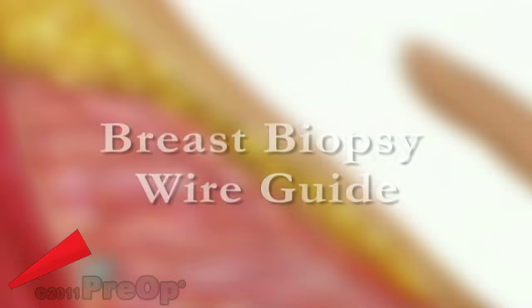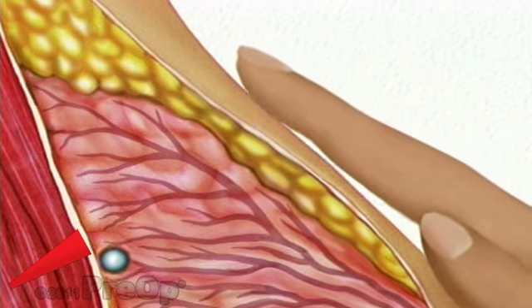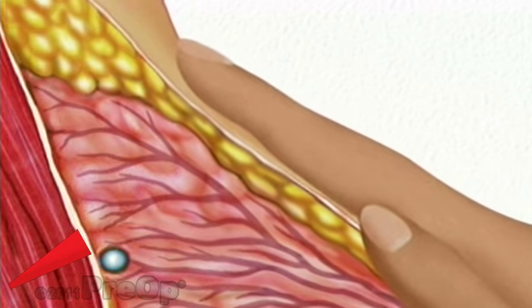Your doctor has recommended that you undergo a breast biopsy procedure, or lumpectomy. In your case, you have a lump in your breast which is too small to be felt by touch. Your radiologist detected this abnormality while reviewing your recent mammogram, or breast X-ray.